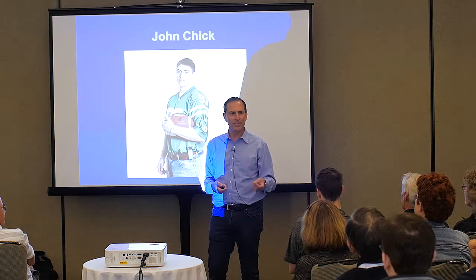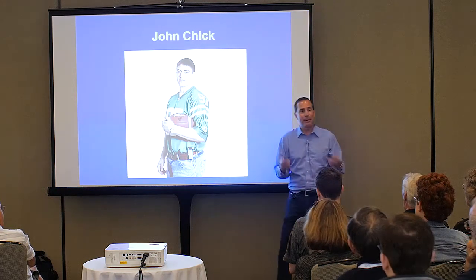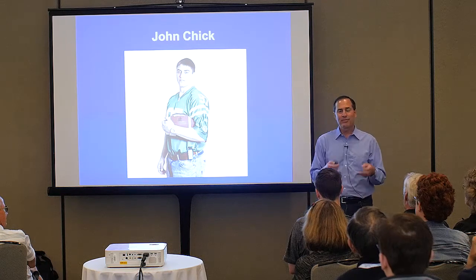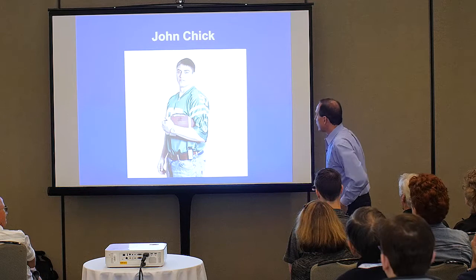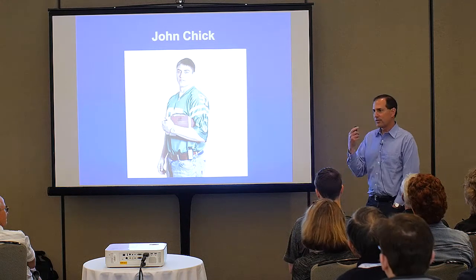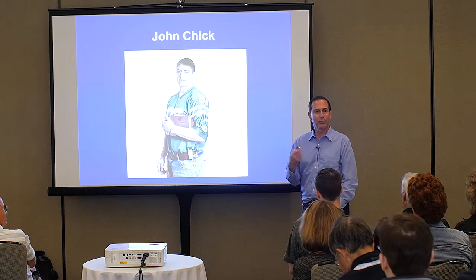These pumps are resilient. And I thought, if he could play in the NFL wearing a pump during games, then when someone's out playing volleyball or whatever else, you can wear a pump. So for those of you that do exercise and don't wear your pump, I would encourage you to reconsider that.